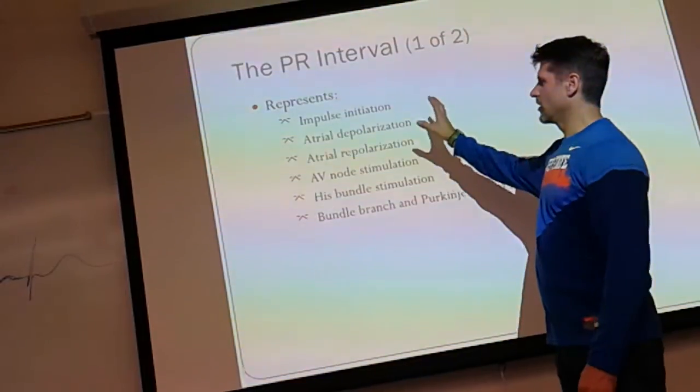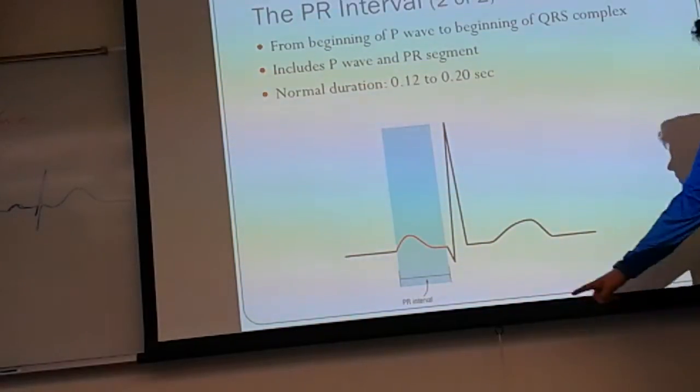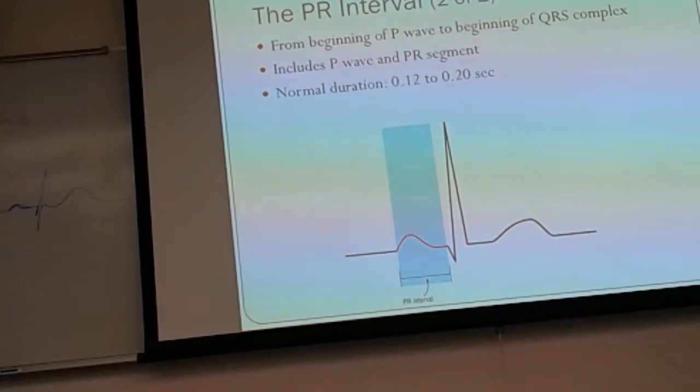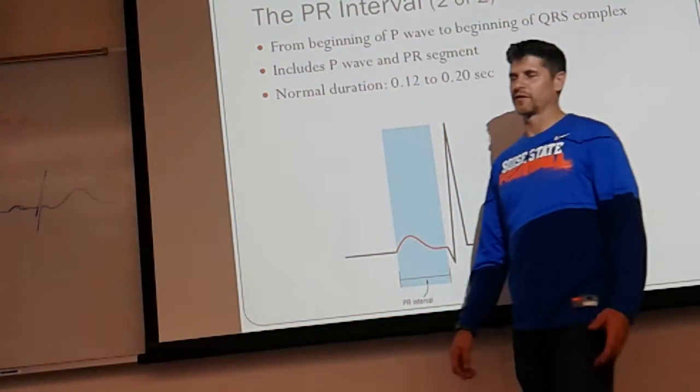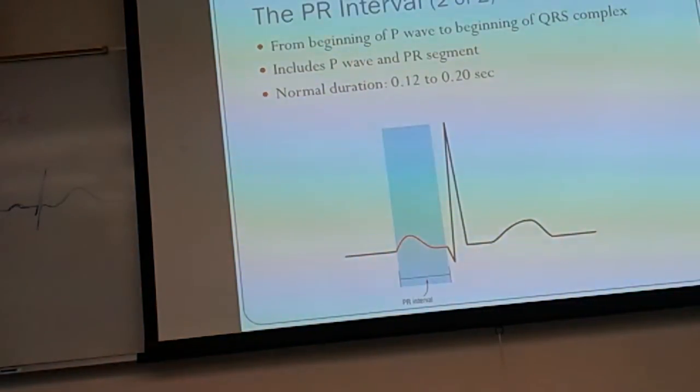That PR interval holds a whole lot of importance. So, beginning of the P wave to the beginning of the QRS complex. Okay, your first thing you have to know, the duration. Not the first thing you have to know in this class, but the first thing here.